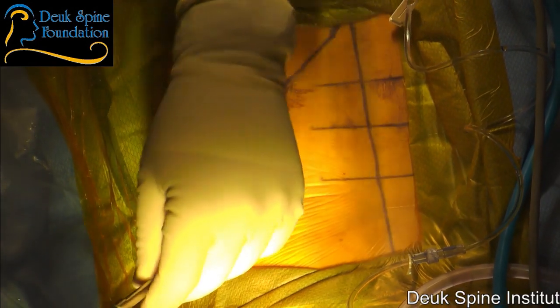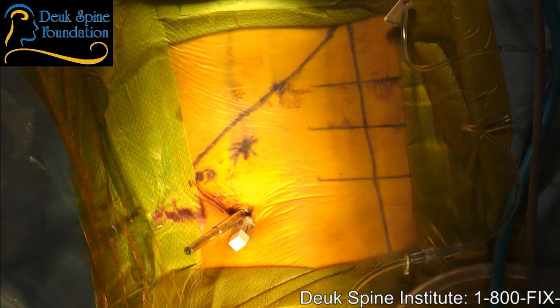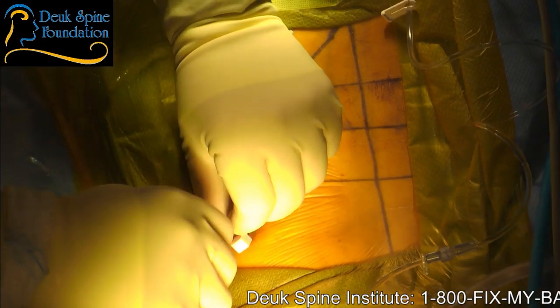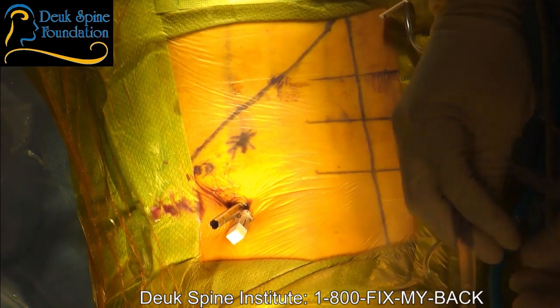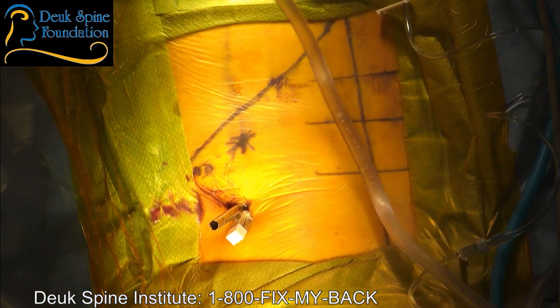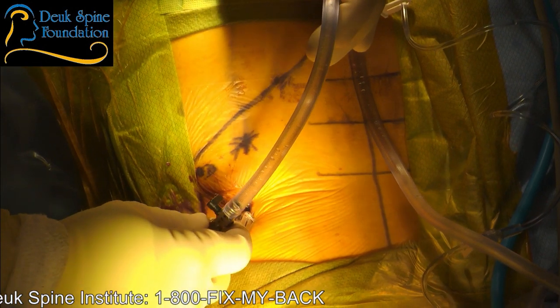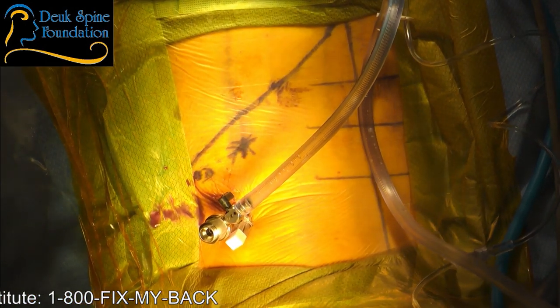Thing keeps coming out. You see that? A lot of intradiscal pressure here. Not sure why, but we're going to find out. Okay, let's get the fluoro out. So we're now treating the L45.